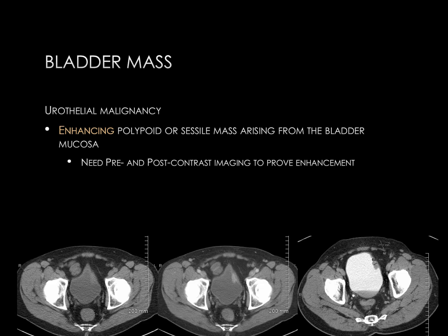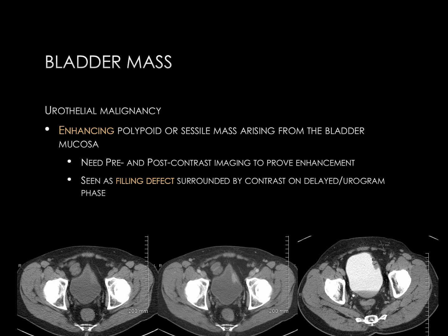At the bottom of the slide, you see three axial CT images through the pelvis. The left image is pre-contrast, the middle image is venous phase, and the right image is delayed phase, or urogram excretory phase. At the anterior left aspect of the bladder, there is an enhancing mass, which you can see on the middle image, clearly increased in density from the non-contrast image. On the delayed phase, the mass is outlined by excreted contrast material. This is a typical appearance of a mass on the delayed or urogram phase — it's seen as a filling defect surrounded by excreted contrast.